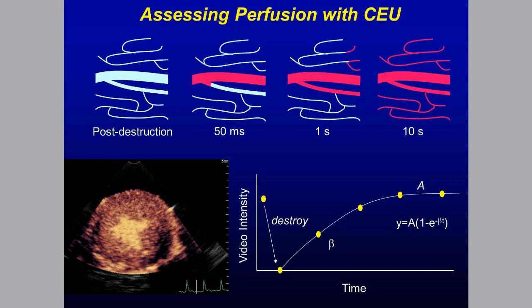If we did 3D echo just like we do 2D echo, we would have frame rates of about 3 frames per second. So there's engineering that has gone into these systems for more retrospective beamforming, to be able to figure out where pixels are coming from after shooting fatter lines. That being said, because of these larger lines that we're shooting, the spatial resolution still is not quite as good, nor is the temporal resolution. So right now, I would say that I still prefer 2D to 3D echo.